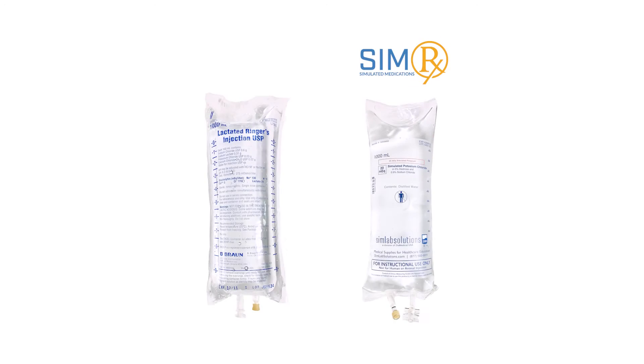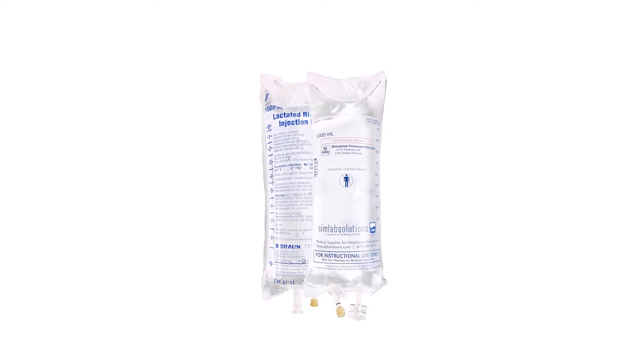Hi! Today we'll be highlighting SimRx simulated IV fluids and blood products by SimLab Solutions. They were specifically created to help educators teach best practices in IV therapy. SimRx simulated IV fluids are designed to replicate their active counterparts in all physical aspects.